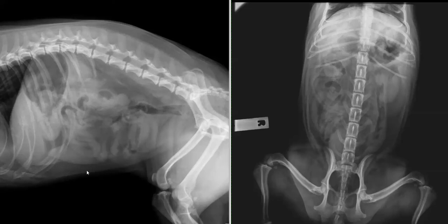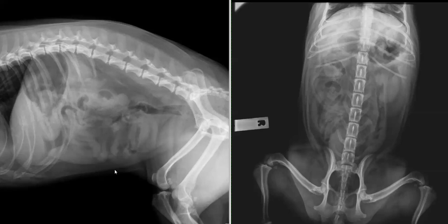Finally we've got the peritoneal cavity. The ability for you to see the peritoneal cavity depends on how much fat is in the abdomen. This dog has a nice amount of fat and good body condition, so we can see quite nicely the edges of the small intestine and the other organs. This changes in an emaciated animal, or when there is increased soft tissue opacity like fluid in the abdomen — then we lose the ability to make out all of these structures.